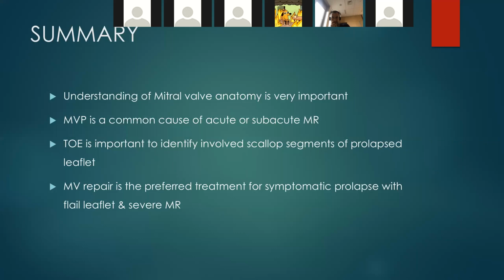These are questions that are loved to be asked in the DDU exams, mainly because if you can understand this, it indicates that you understand echo. If you can answer these questions, it's a really good indication that you know your stuff. So worth having a think about, maybe looking through this presentation again.